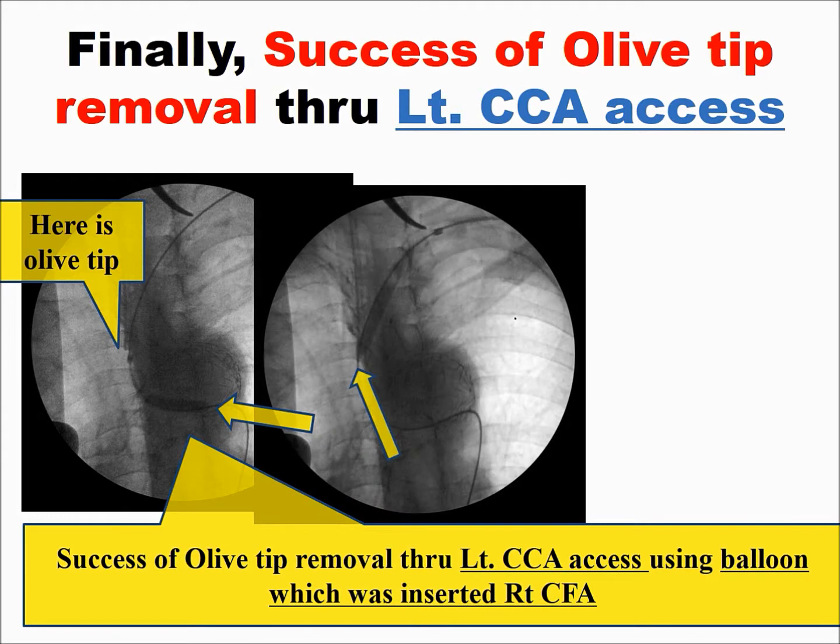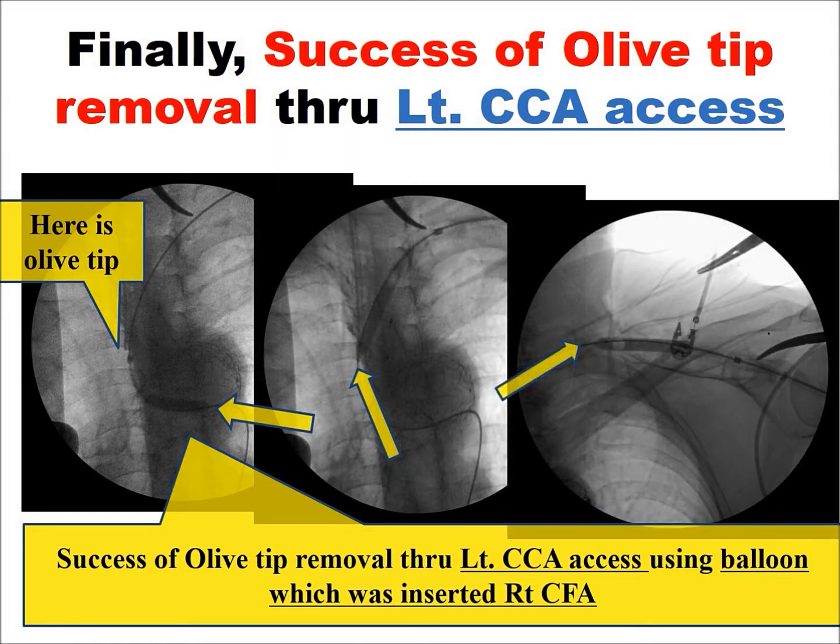So I thought the carotid graft could be another way to retrieve the olive tip. I pushed the olive tip with a small-sized balloon inserted through the right common femoral artery in this upward direction. Fortunately, I succeeded.